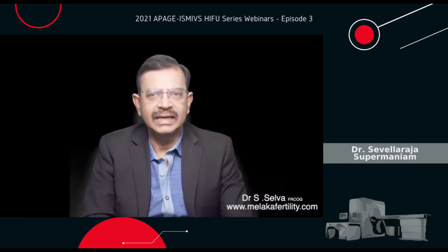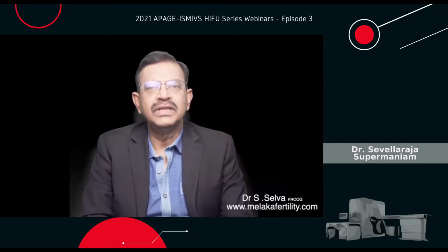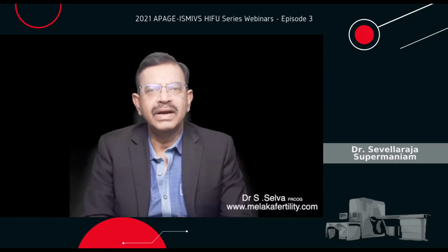We usually tell them that there are two options. Number one, to make an appointment to see me for consultation. We usually arrange for a consultation early in the morning. After the consultation, an ultrasound will be done. After that, we will arrange for an MRI to be done. After reviewing the MRI, we will then do a simulation on the HIFU machine to see whether HIFU can be done. Once simulation is done, then we will arrange for the HIFU surgery. We will then fill up the necessary forms for insurance claim and fix a date for the procedure.